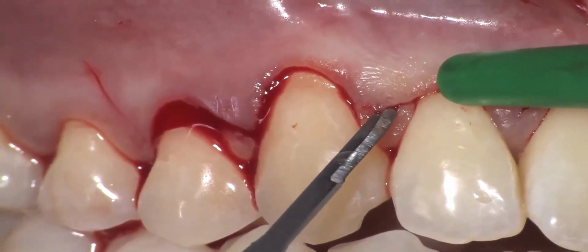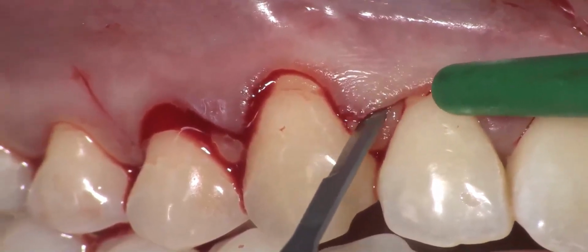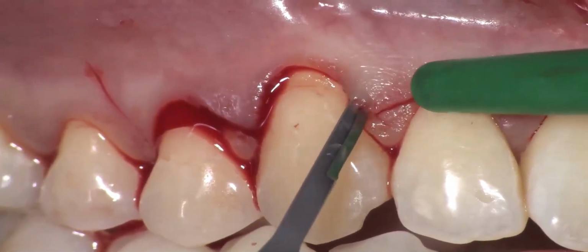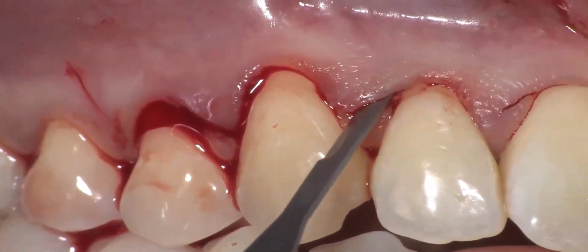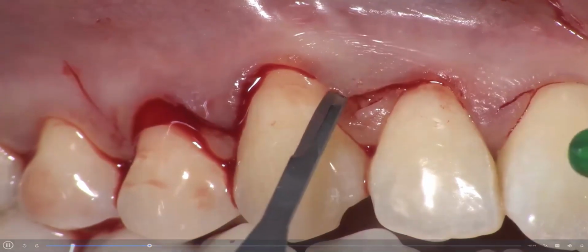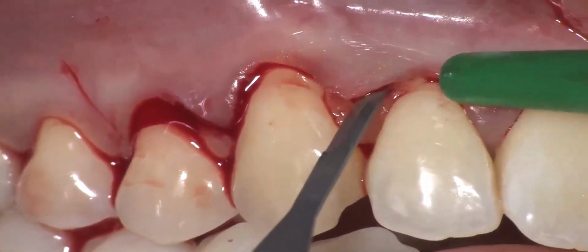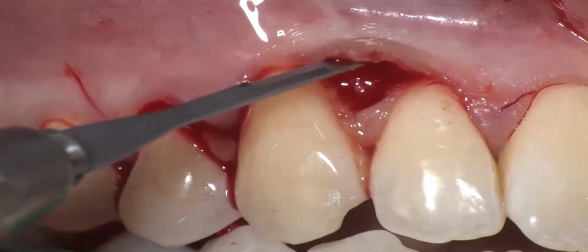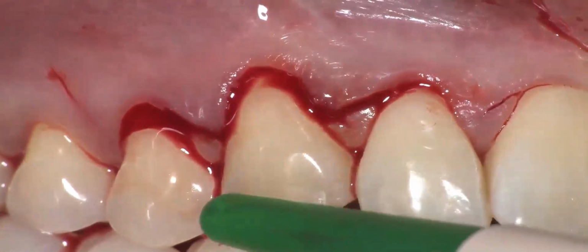We want to keep the integrity of the tip of this papilla also. And once this angle has been elevated, we can go parallel until the sulcus area of the canine. So now another surgical papilla. 1, 2 surgical papilla have been elevated.